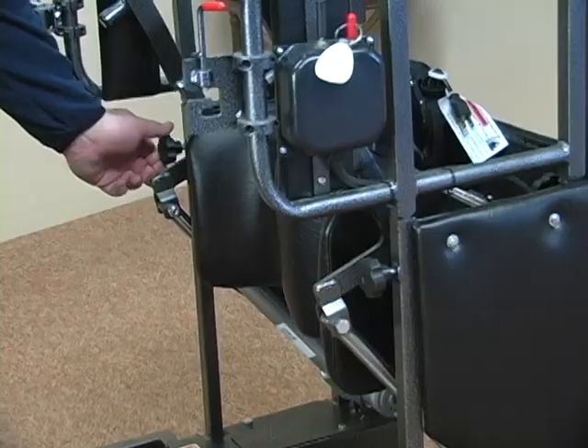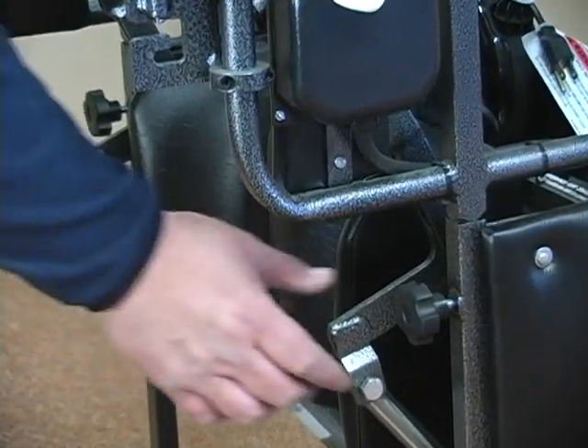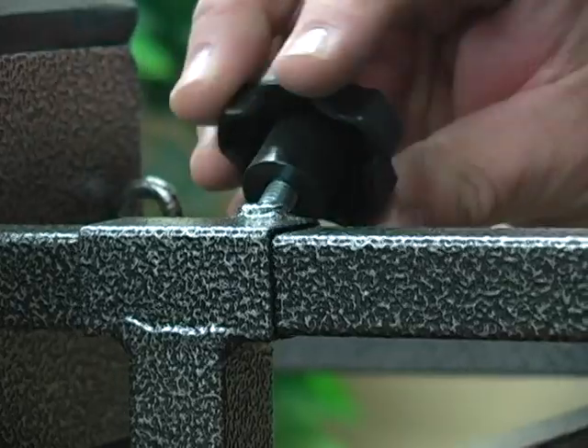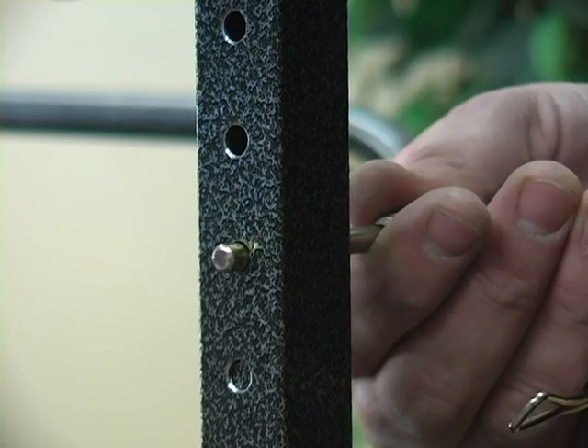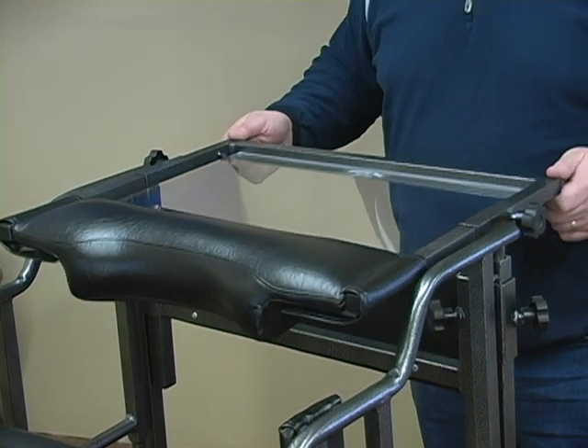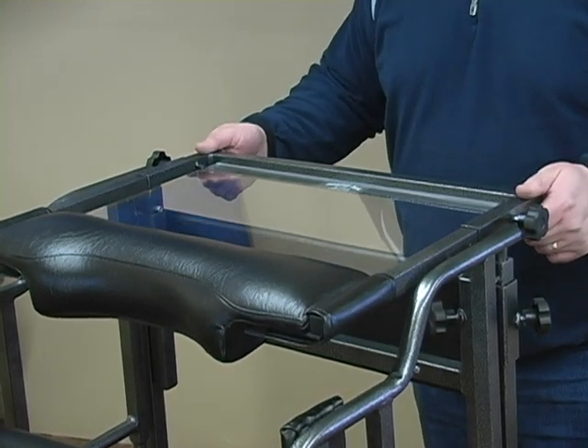Stand-Aid systems enable users to stand comfortably and safely with secure padded support areas. Easy tool-free adjustments allow proper body alignment for maximum weight bearing. An adjustable plexiglass table tray is located in front of each standing system.